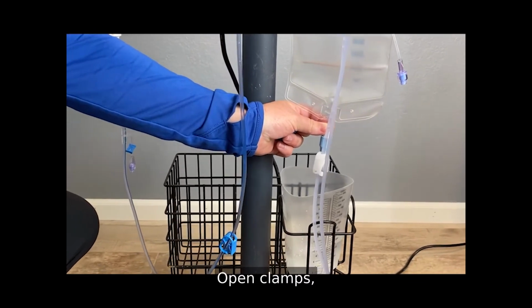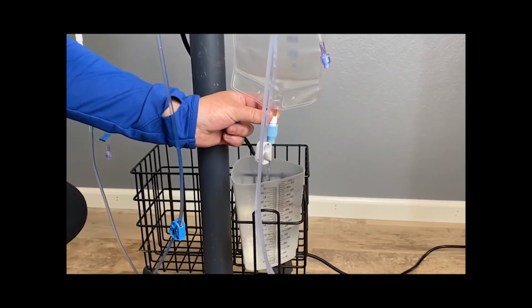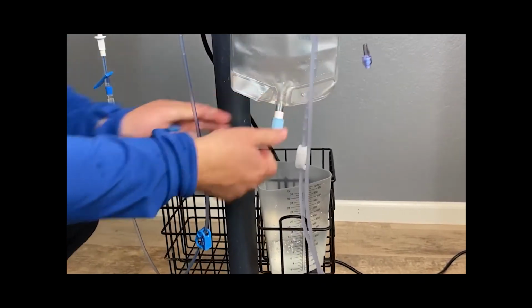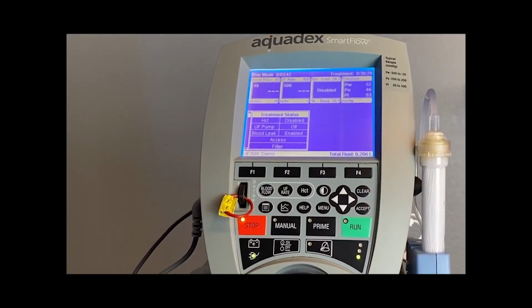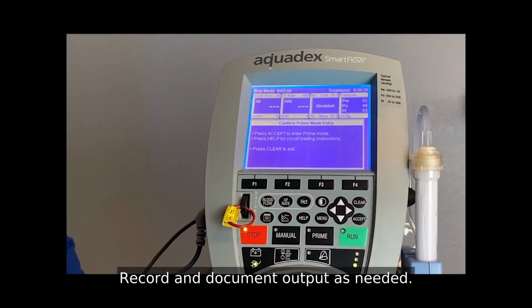Open clamps. Empty any ultrafiltrate out from the UF bag. Record and document output as needed.